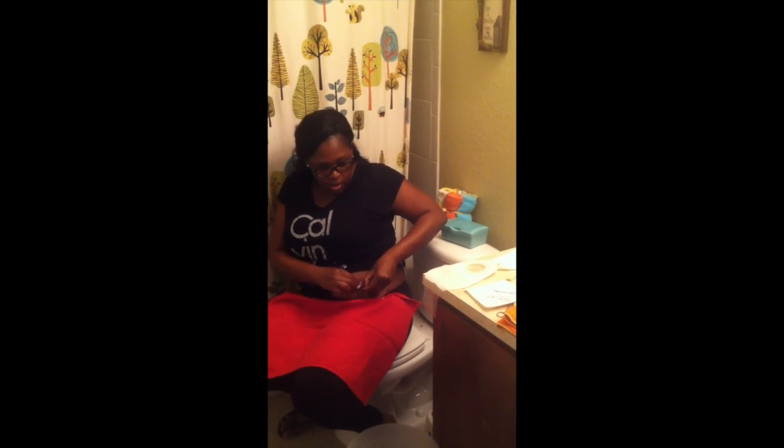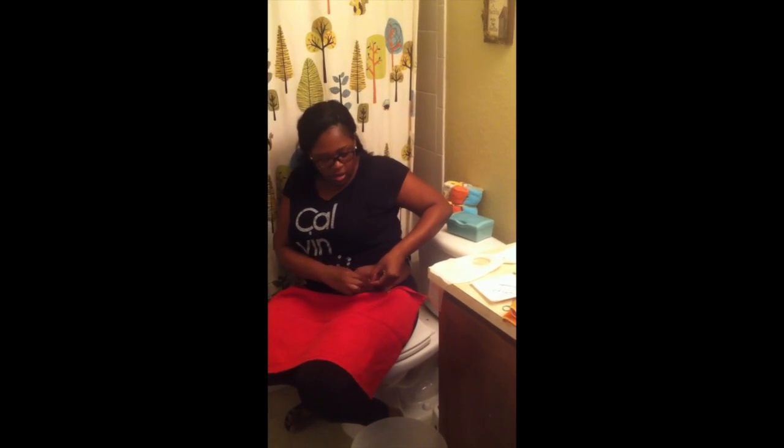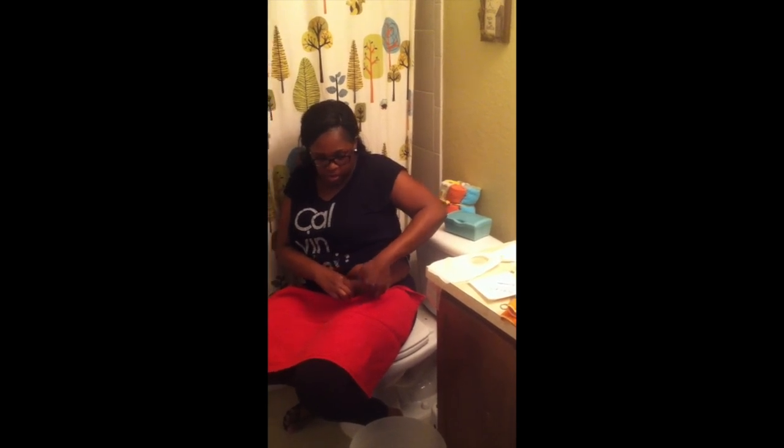Is it pretty sore underneath there? I don't feel anything. The stoma itself doesn't hurt because there's no nerve endings in the actual stoma. And plus I've taken my medication so I don't feel any pain. Okay, I'm just getting around the other side.